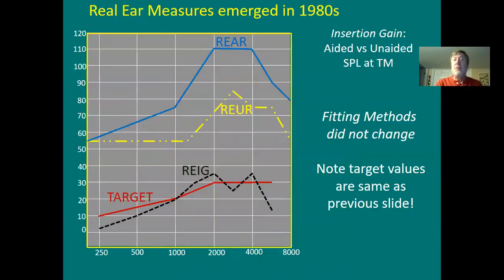Today we do real ear this way. We take the unaided ear canal resonance, in yellow. We put a tiny probe tube in the guy's ear, and we measure his unaided ear canal resonance, which usually has a peak around 2,700 hertz. And then they would hold that tube carefully in place, and put the hearing aid on top of that tube. Don't disturb it. And then they turn the hearing aid to a comfortable loudness level, and you'd see what your real ear aided response was.